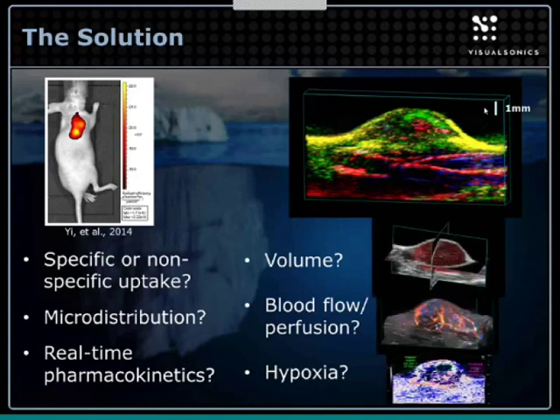And of course, other aspects of the system, including the ultrasound, Doppler, and also the photoacoustics, which you're looking at in the top right image and the bottom right image in this slide.